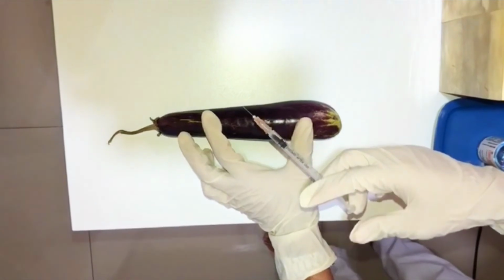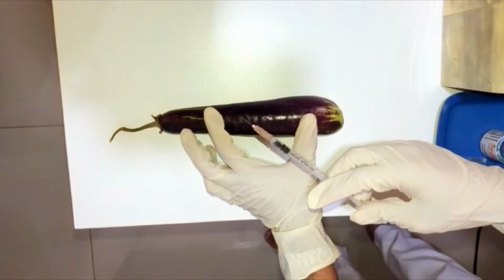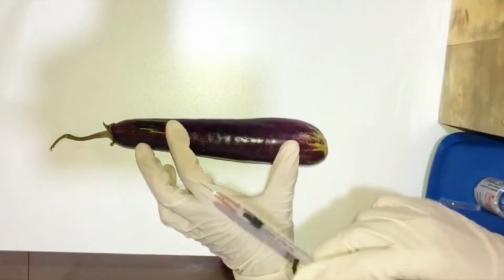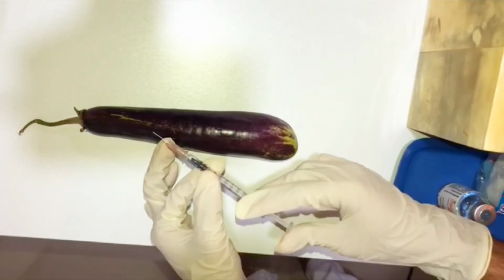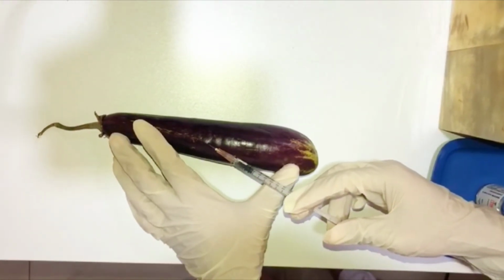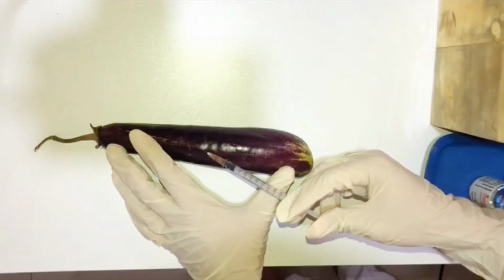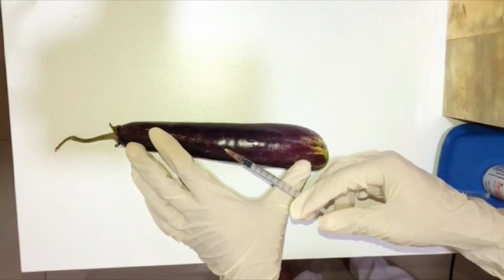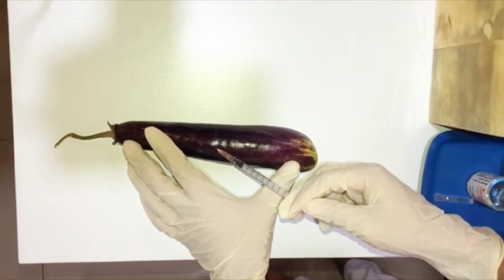Slowly inject the medication and feel the resistance until you see a bleb that resembles a mosquito bite appear on the patient's skin. Withdraw the needle at the same angle that it was inserted and pat dry with a cotton ball.